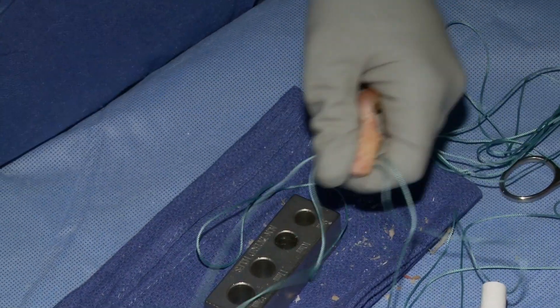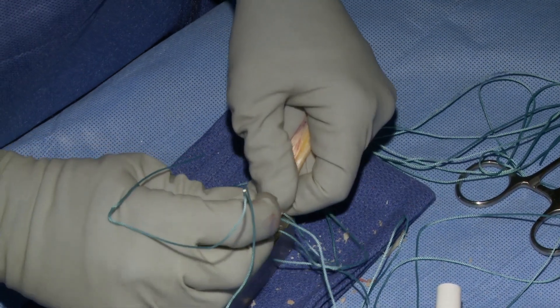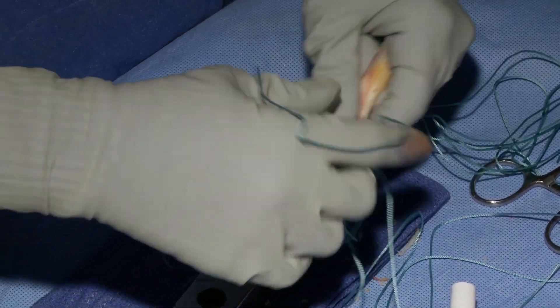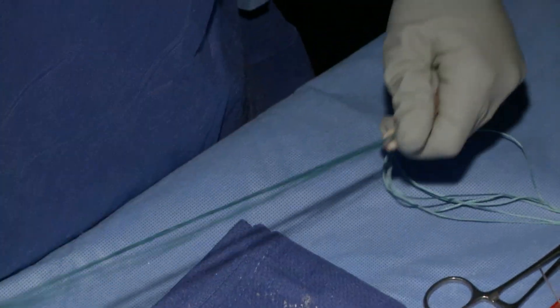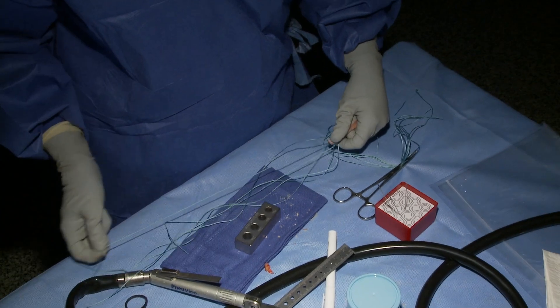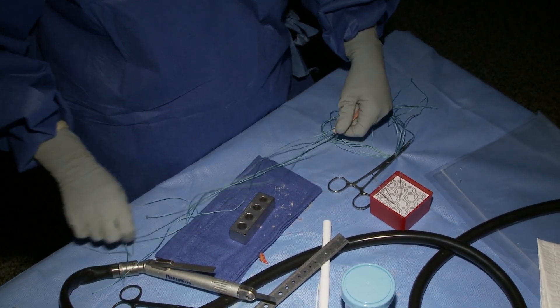I make sure that I really bullet the end because this is the side that's passing through the knee, and you do not want any sharp edges to hold up graft passage within the knee because it can be really frustrating for the surgeon when you're passing the graft.